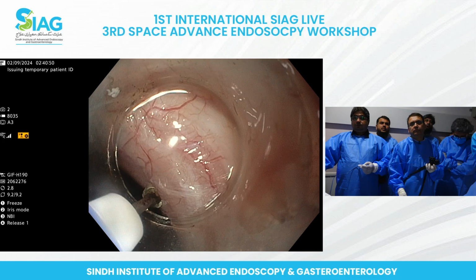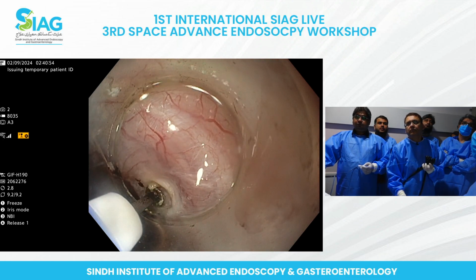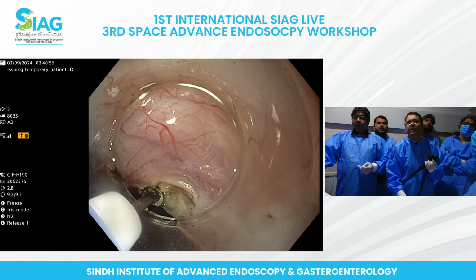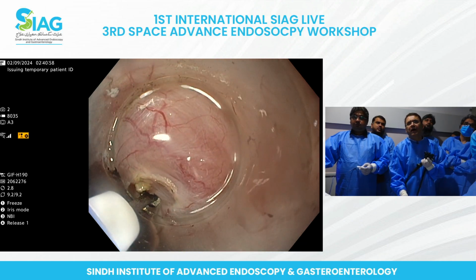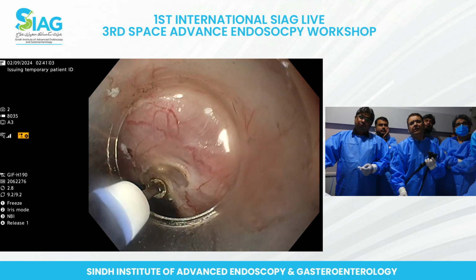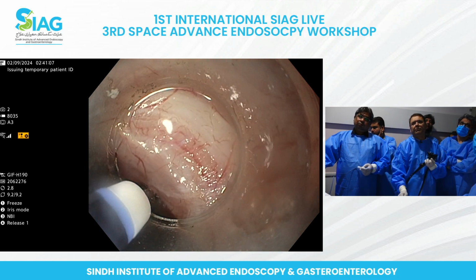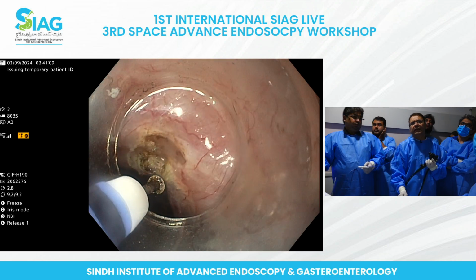Are there any precautions that you need to take differently when you're doing posterior? No, not really. It's the same approach, just posterior. One thing is the entry becomes a little bit easier with the posterior.